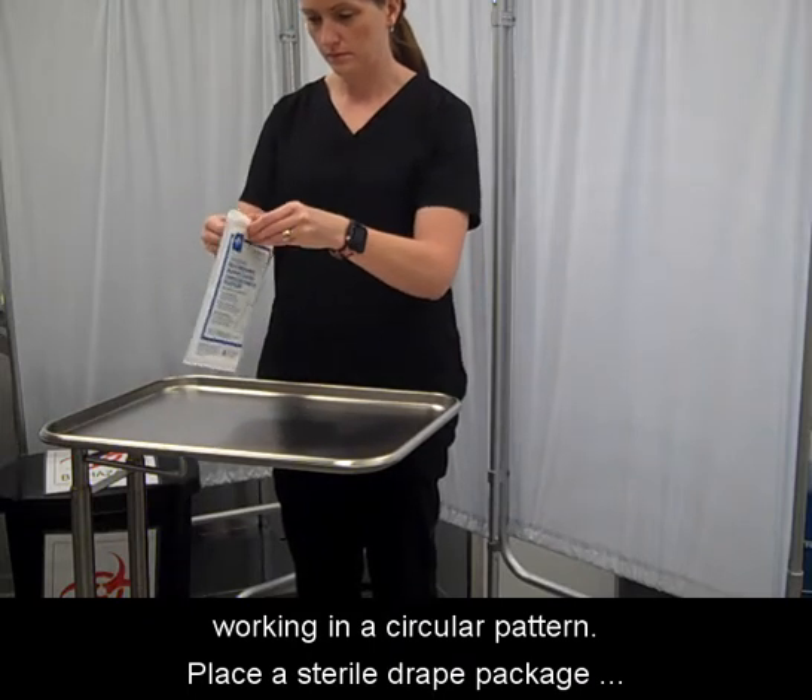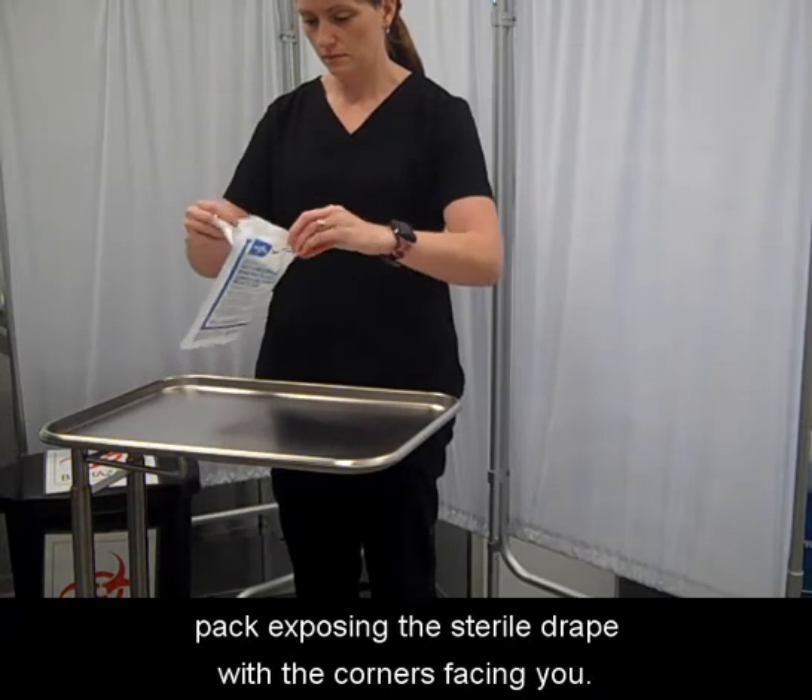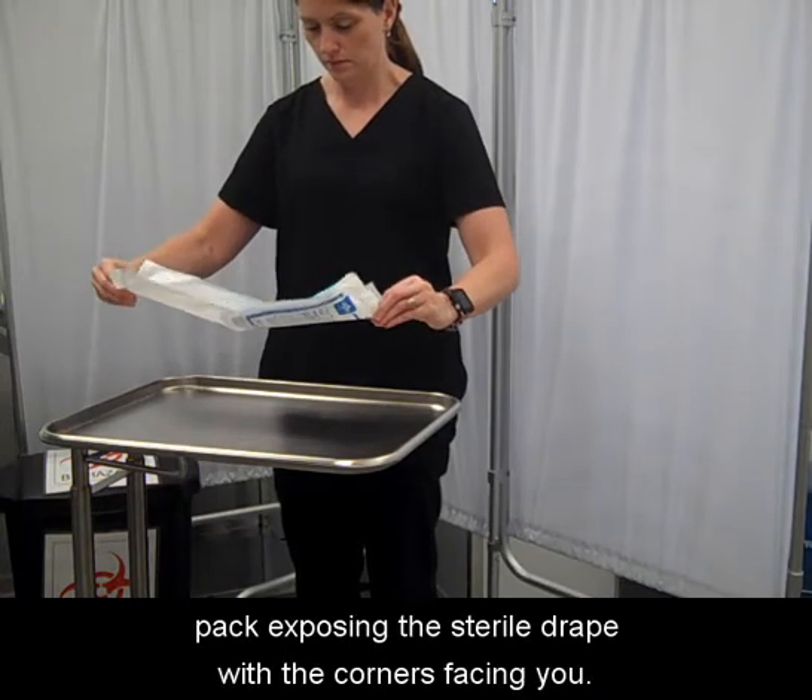Place a sterile drape package on a clean, dry surface and open the pack, exposing the sterile drape with the corners facing you.